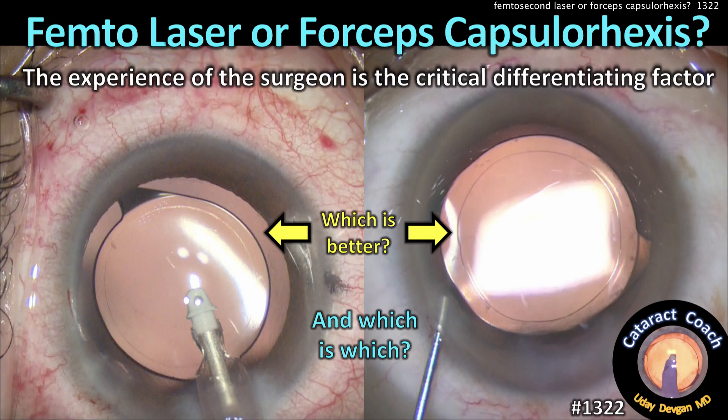CataractCoach.com. Femto-laser or forceps capsulorrhexis? Which is better and which is which? Look at that picture — can you even tell?